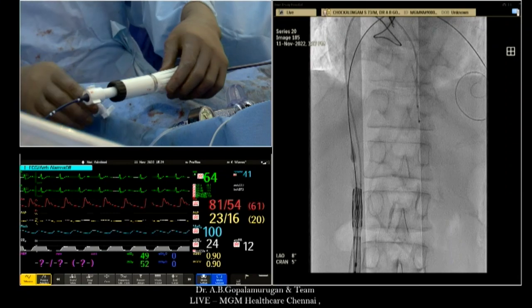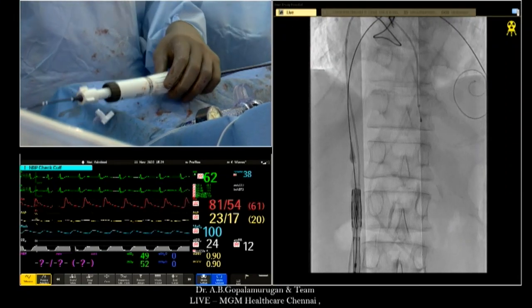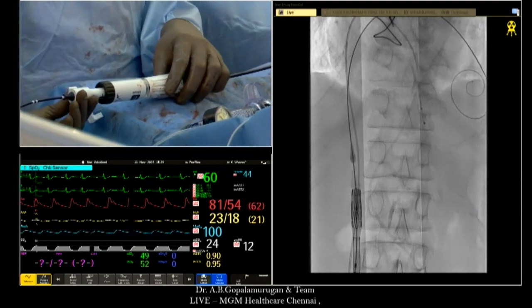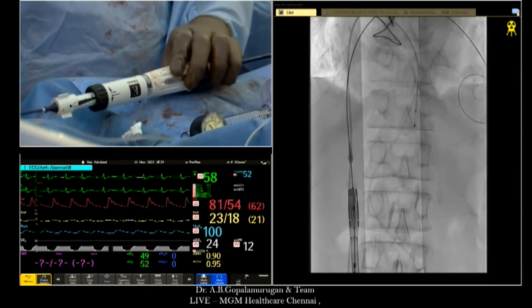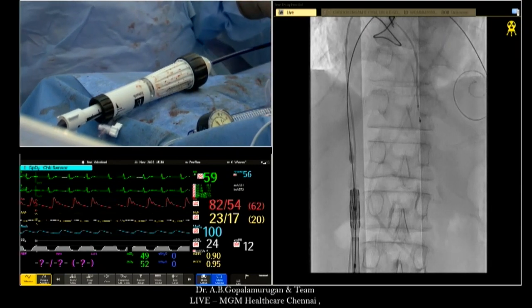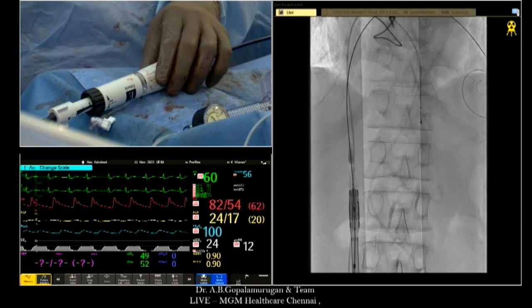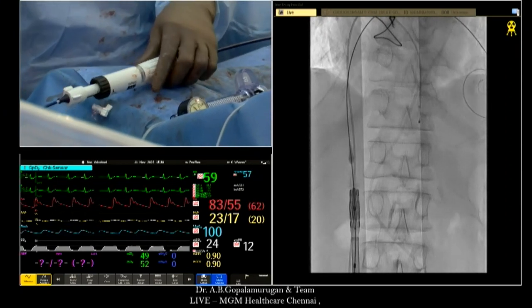Okay, so just a note with the Sapien system, we have the E facing downwards, because normally for a TAVR, you'd have it facing upwards. If you have it facing upwards, the Flex Commander system rotates to the right of the patient. But if you have the E downwards, the Commander system will rotate to the left of the patient, and that's what I want in a mitral.